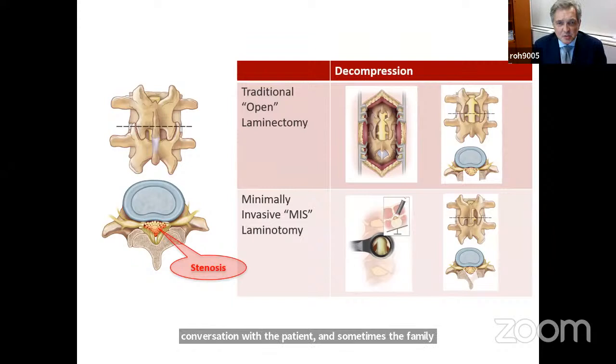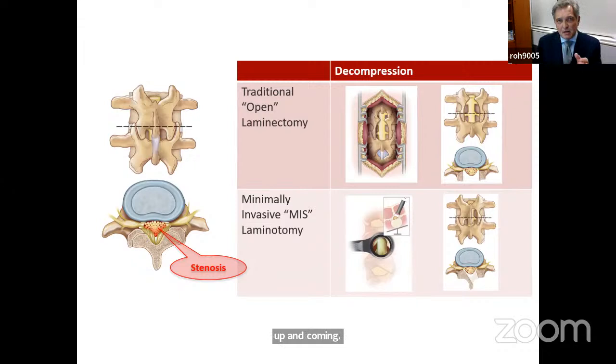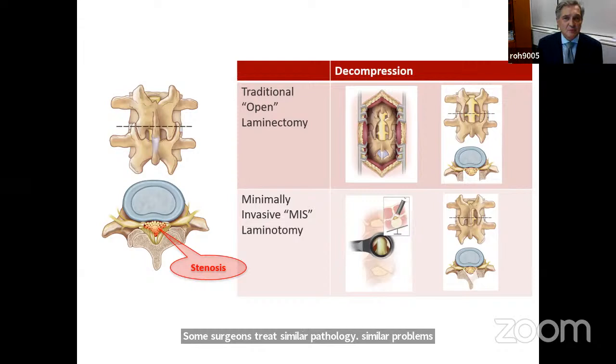But this is really, I would say, one of the most common operations that I do these days. So that's a tubular operation for lumbar decompression. Somebody asked about endoscopy. Endoscopy is a very exciting technology that's up and coming. Some surgeons treat similar pathologies, similar problems with lumbar stenosis through the endoscope. Currently, it is a time-consuming endeavor in my experience, but I'm sure if you come back in 5 or 10 years, the technology will be such that a lot of what I'm doing now through the tube, maybe in 10 years we'll be doing with the endoscope.